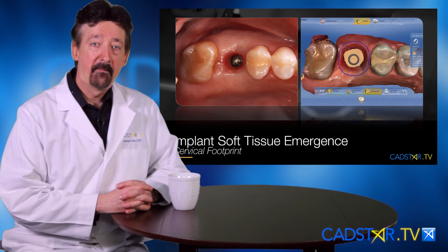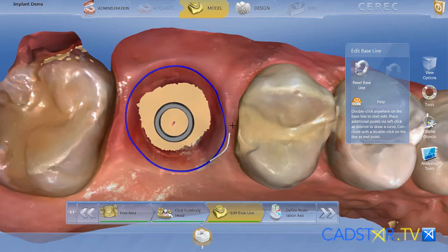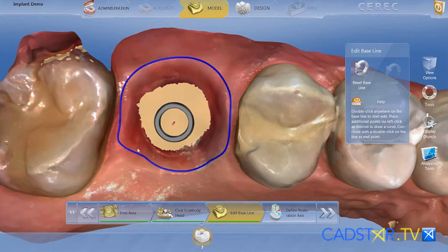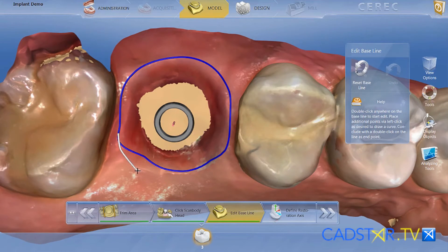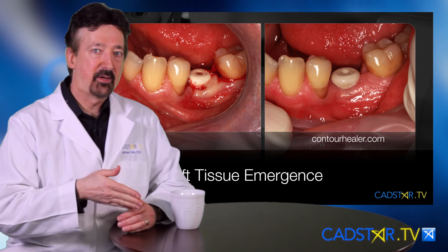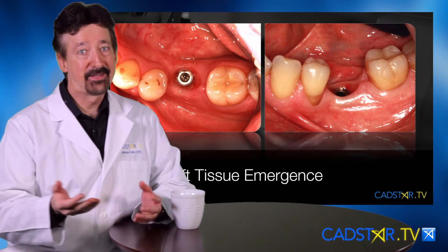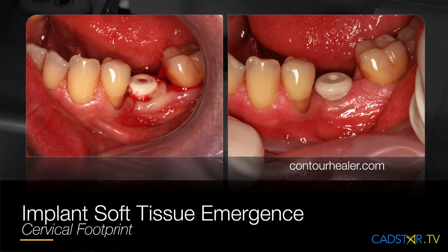Think of it this way: if you're wanting to design an ideal ovate pontic, you're going to take that baseline and draw it similar to the diameter of the root trunk. With best implant design using the CEREC system, you want to form the sulcus first, such as with an anatomical healing cap.